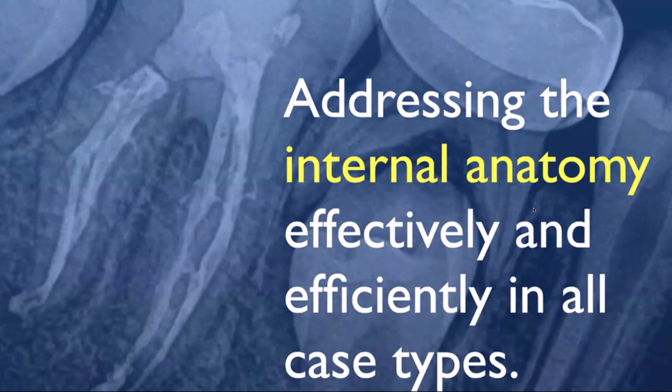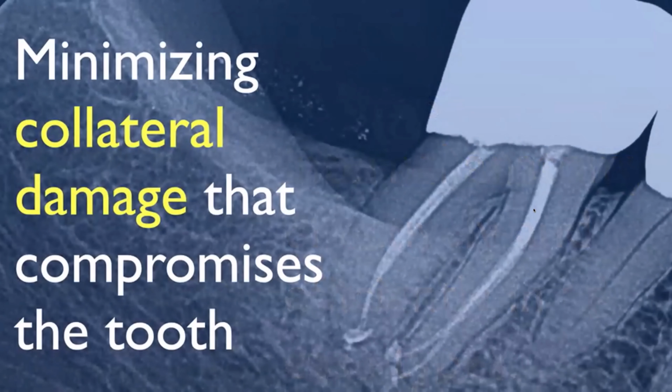But really, what we're here for, and what we think to ourselves, is that in endodontics our intention is to address the internal anatomy in all case types as effectively and efficiently as possible. So that would mean, how can we clean and disinfect a tooth ideally in a one visit setting? The challenge that we have is in the past we had the capacity to do that, but it came at the expense of tooth structure.